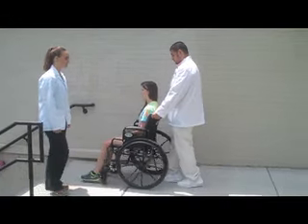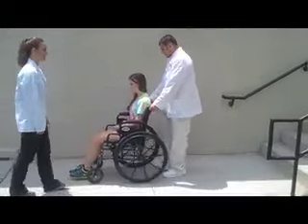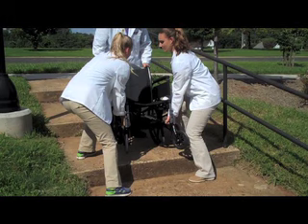Step 1. The clinician backs the wheelchair to the bottom of the stairs. If the stairs have railings, two people should assist in the lift. If the stairs do not have railings, three people can be used for the lift.